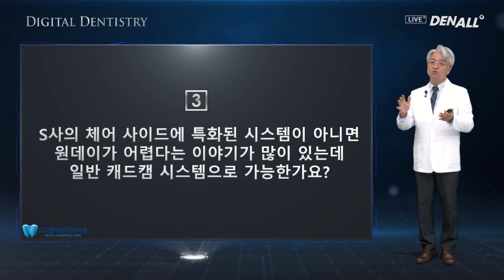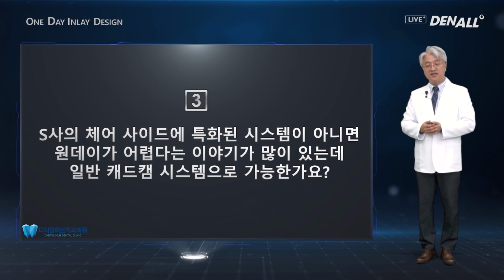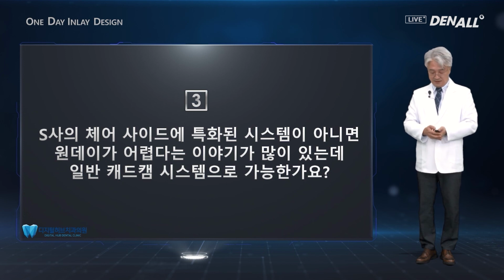So a lot of constraints have now been overcome, and all these are now available in your clinical setting. So without this customized system, with the general CAD-CAM system, I believe the one-day approach is now possible.